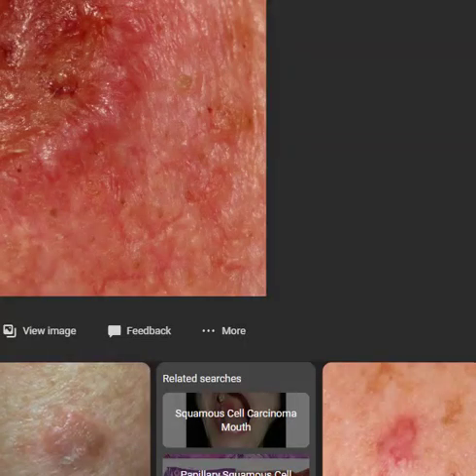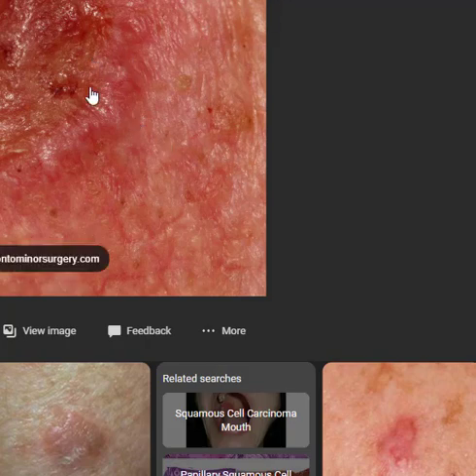Your outer and inner skin cells are squamous epithelial cells, and they're nice, shaped, flat. They kind of look like a fried egg. Squamous is squished cells. This happens to be a picture right here of a tumor that's growing. This is a squamous cell carcinoma.